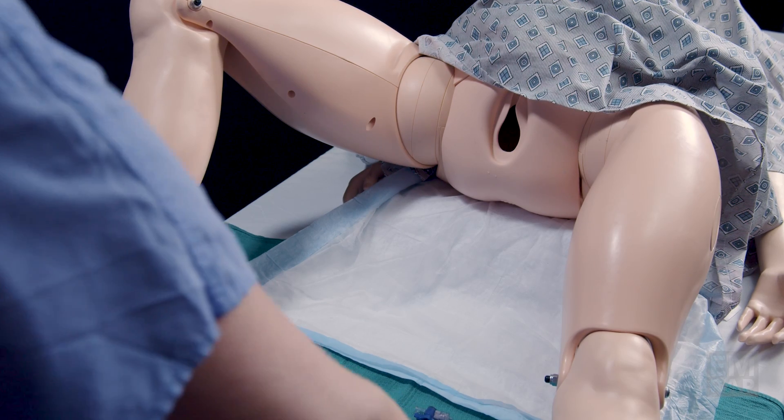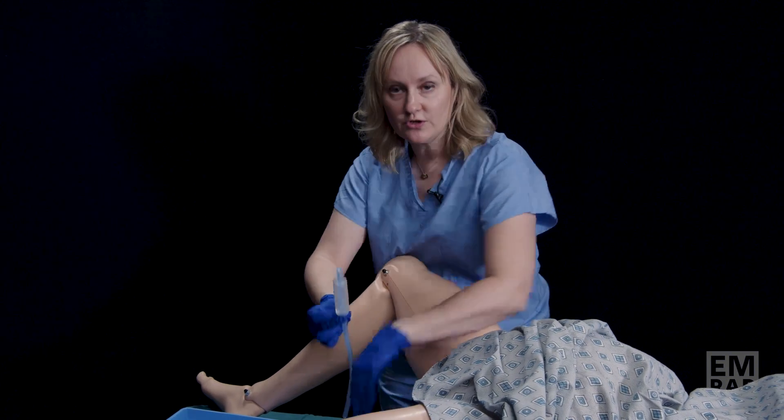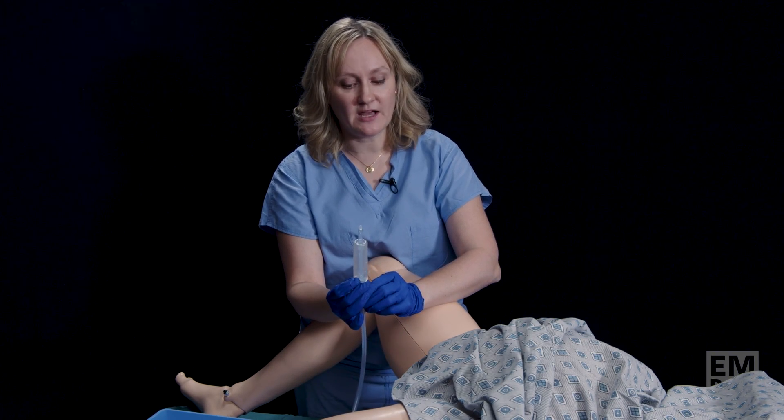The first step is to place the Bakri balloon. You can use a set of ring forceps to help guide the balloon into the uterine cavity. You do not want to use any forceps that may have a pointed tip, as this could perforate the uterine wall. You can also place this just using your hands — that's what we'll do here.